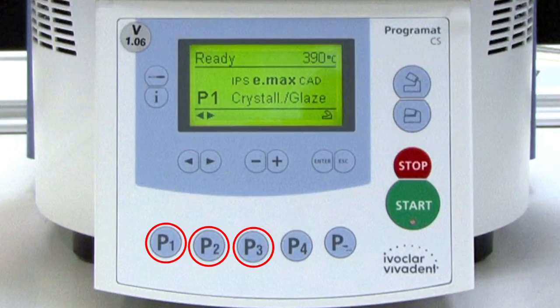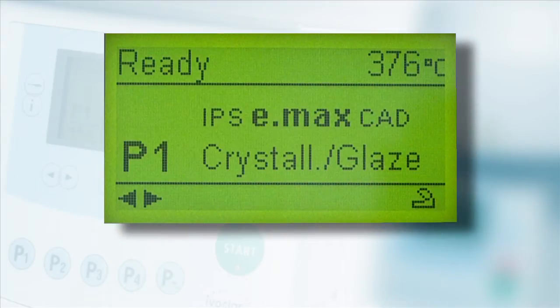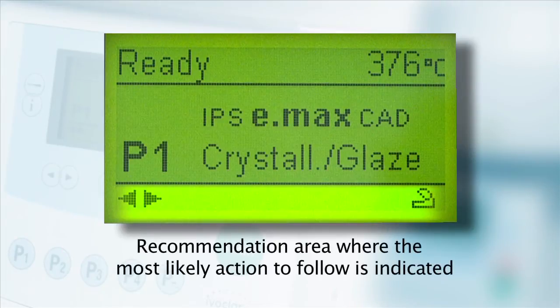The program keys 1 through 4 and the next program key are used to select the firing programs. In standby mode, the status area of the display will read 'ready' along with the current temperature of the furnace. The main area will display the currently selected firing program number and name. The bottom of the display is the recommendation area, where the most likely action to follow is indicated.